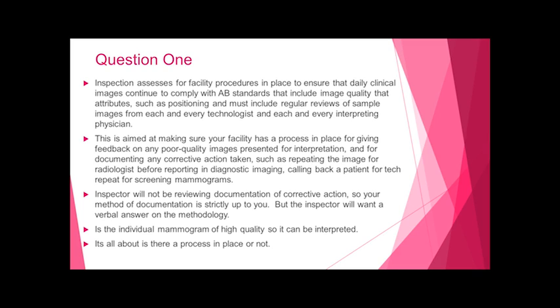What is your process of correcting the problem? So maybe it could be we're sending our technologists to classes. We brought a person in here to do hands-on, or so on. Something to tell them if every single image is not in compliance of accreditation body standard. What are you doing to improve it?